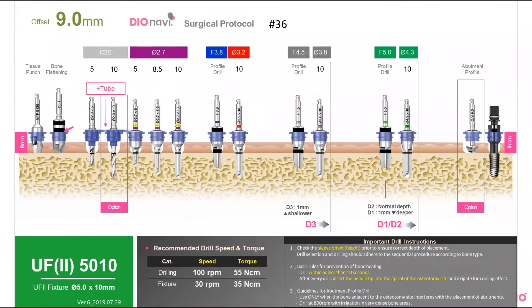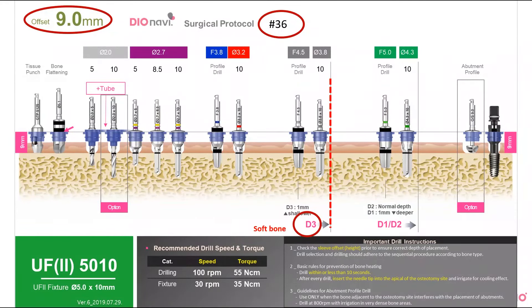Before you start drilling, check the offset — in this case it is 9 millimeters. Also check the tooth number, which is usually written on the top of the page; in this case, the tooth number is 36. You can keep drilling up to the 3.8 diameter drill, where there is a line marked D3 on the bottom. This means that if the bone is softer than D3, you can stop there and go straight to the abutment profile drill, then place the implant. However, if the bone is harder, like D1 or D2, drill further to the 4.3 diameter drill, then use the abutment profile drill.